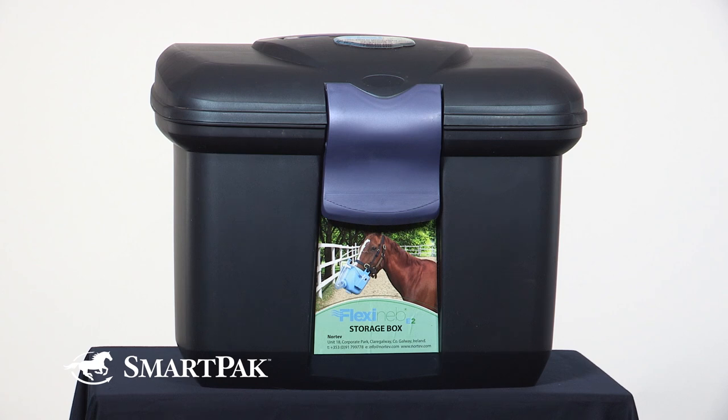The best way to store the nebulizer is to put it in the box that it comes with, and for myself, I keep it in the feed room. Really try to find a place to keep your nebulizer out of a dusty or dirty area.